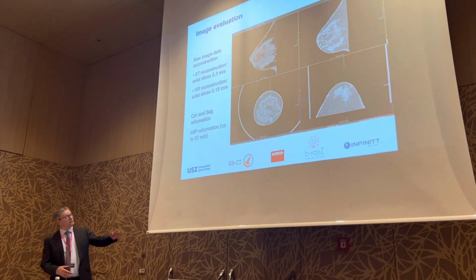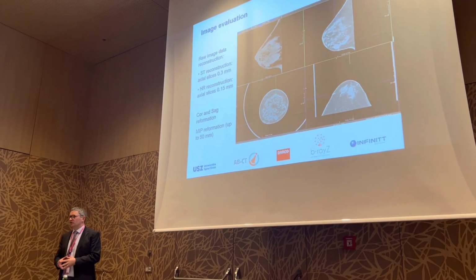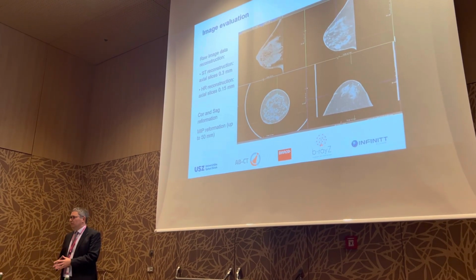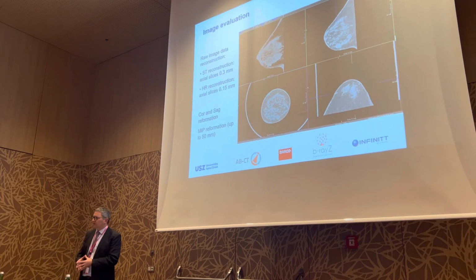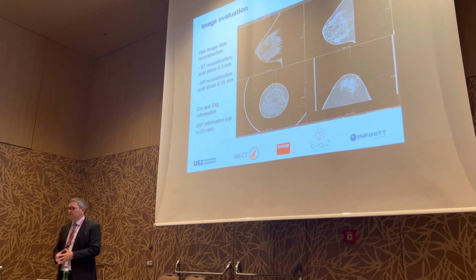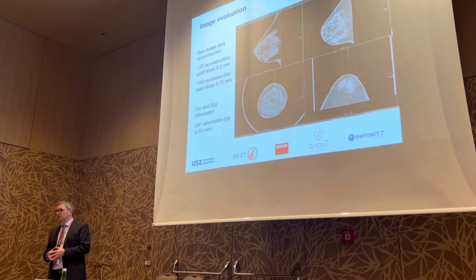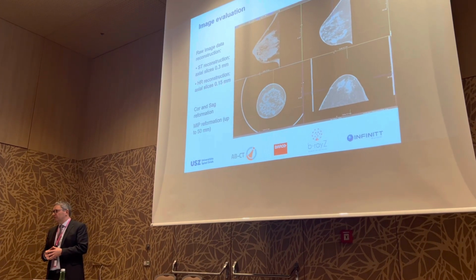Also, it is important to find microcalcifications. The whole system would not be reasonable if it's not possible to reliably detect microcalcifications. And it is possible, and you have example cases on the PACS system here where you can appreciate the quality with which microcalcifications can be depicted.